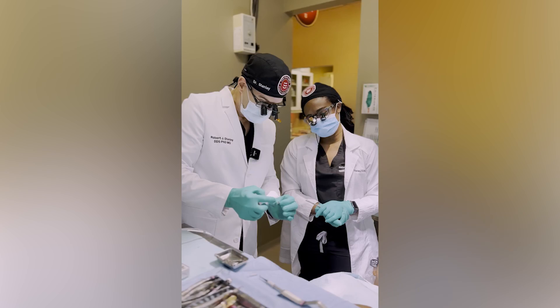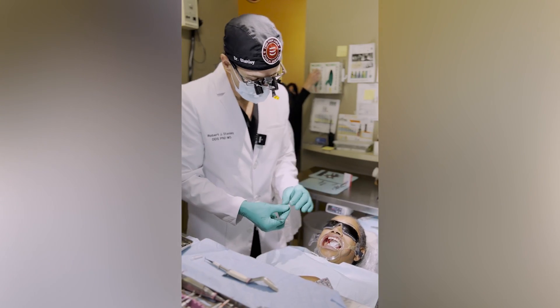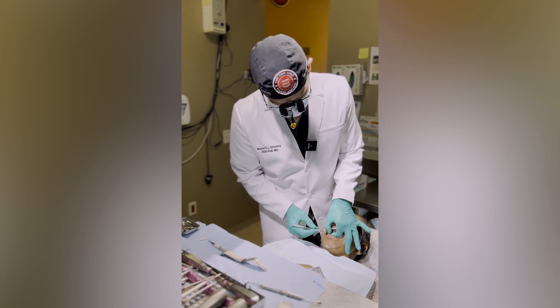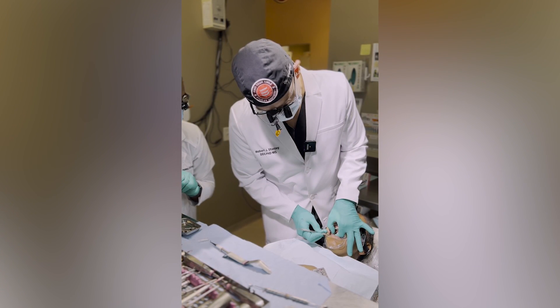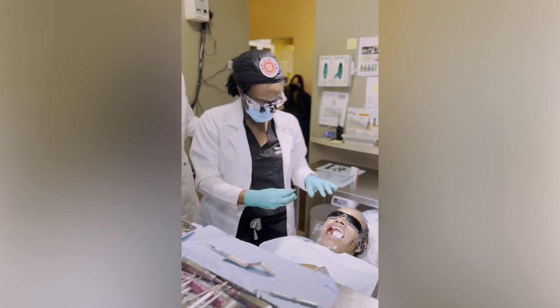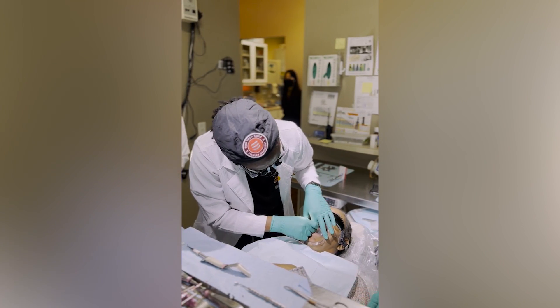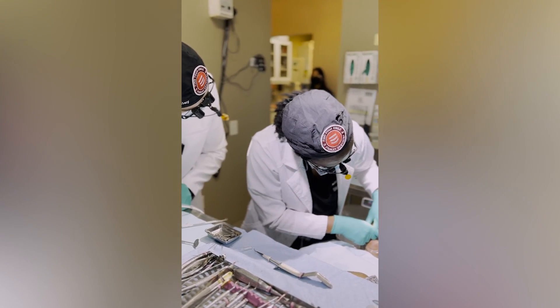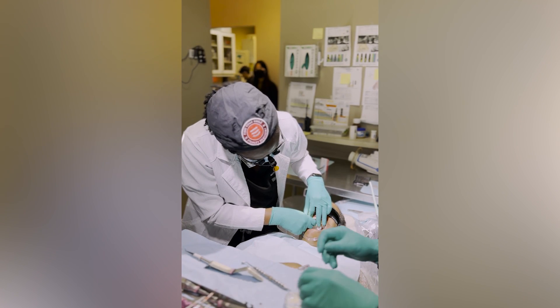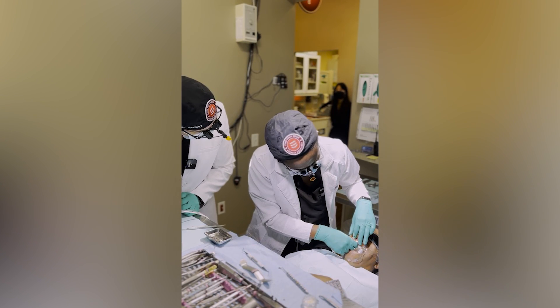We've got to apply a little cover screw, and you can't get your finger in the way, so let me show you a little trick. I'm going to put this very lightly on top of the implant, place the ball burnisher right in the center, and then rotate with my left hand. If you can get your fingers in there without creating any off-axis loads, you're fine. Just axial loads — no off-axis loads. This is really important for these immediate placement sites because there's not a lot of bone on the lateral aspect of the implant. Just snug it up and pull it straight out.